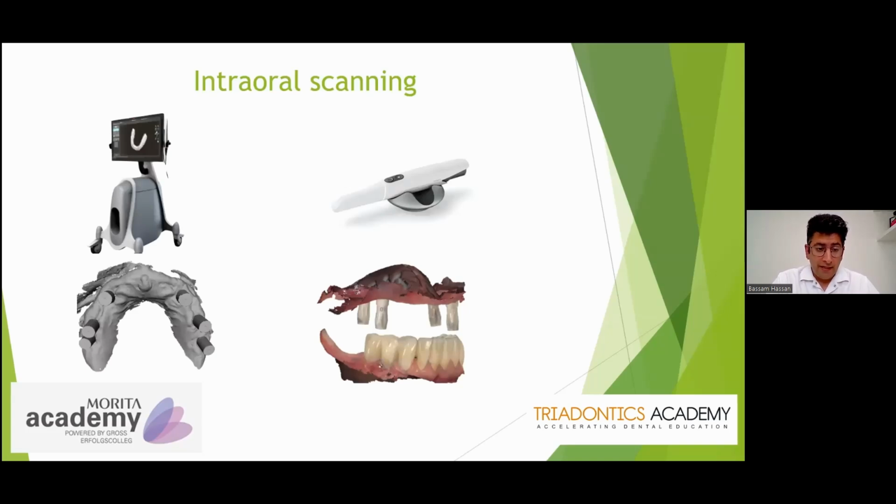Like I said, the scan I made more than 10 years ago, I made it with a PhD candidate at the Department of Prosthodontics, because it took more than 1 hour, and I don't know how many repeats, to capture an intraoral scan position of 6 implants with the 3M True Definition scanner, which does not exist on the market anymore.